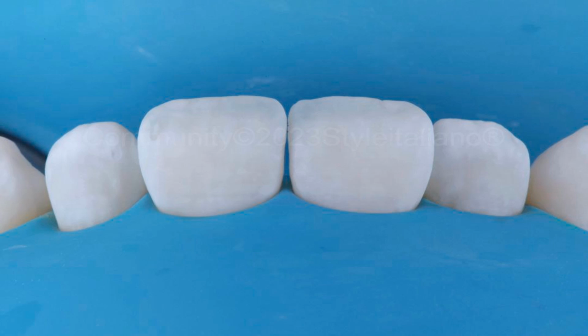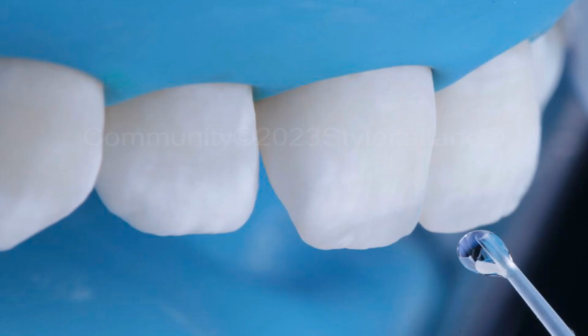The etchant is thoroughly rinsed and the tooth dried. There is an immediate frosted appearance of the teeth, with localized white patches still visible. After that, we apply ICON Dry, which is 99% ethanol. This has two functions: to dehydrate the teeth to maximize infiltration, but also to test drive what the tooth will look like once infiltrated.